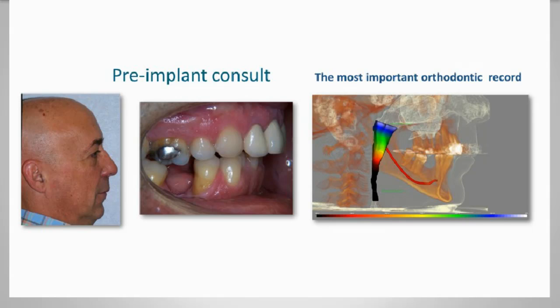We have a couple options here. We can do single tooth treatment, upright the molar, and make space for an implant, or we can treat Tony more comprehensively and educate him. A lot of patient education is required. Talk to these patients. These visuals are great. Patients get it. They understand it when they see this. Everybody wants to live longer and healthier. So it does require a little bit of time, but you educate these patients. You explore their options.